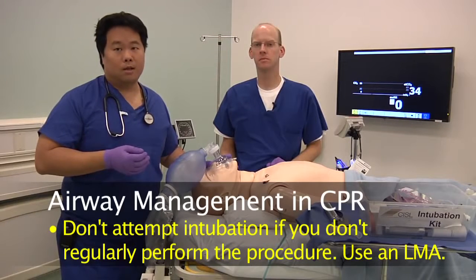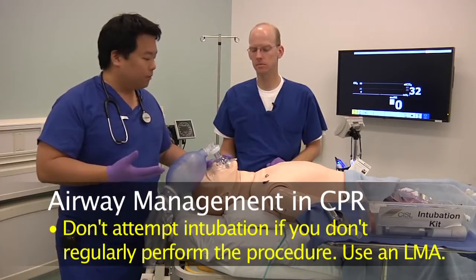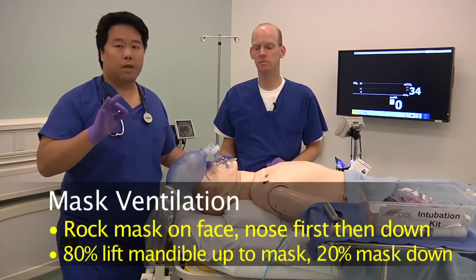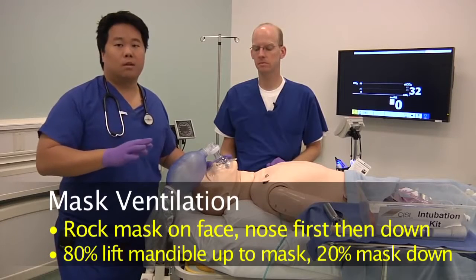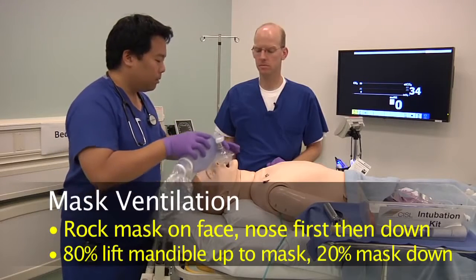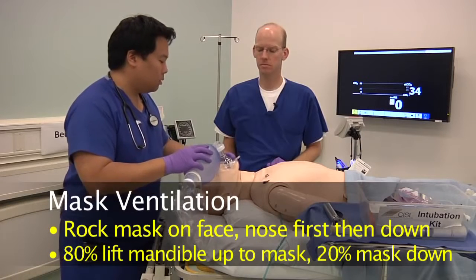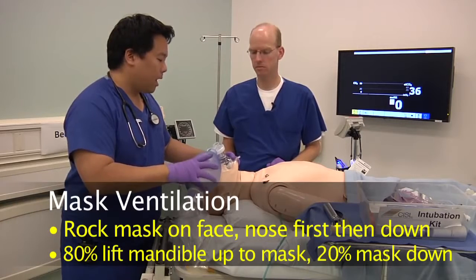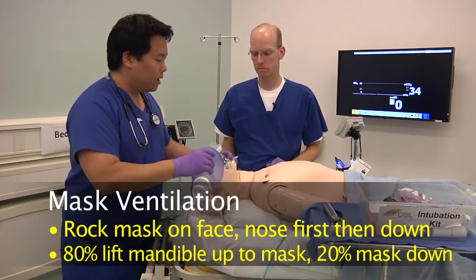And there are other techniques that you can use, such as laryngeal mask airways, or even mask ventilation. Let's actually talk about mask ventilation. This is a very useful technique that can often give you time and bridge the period between apnea and when you can secure the airway. So what we want to do here is to apply the mask to the patient's face, starting at the nose and continue down and tilt down. And then with your fingers here, lift up on the jaw and create a seal. And sometimes you might have to rock back and forth to get a good seal. And then you can go ahead and give a breath.